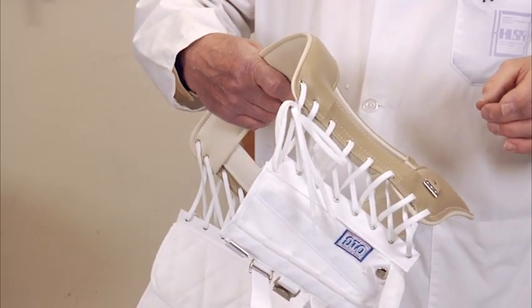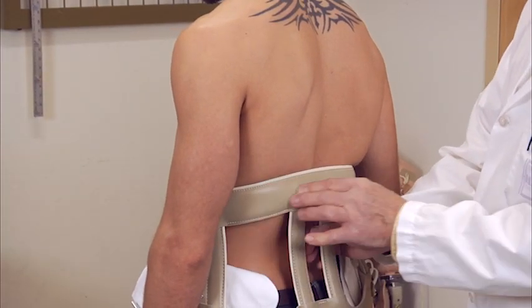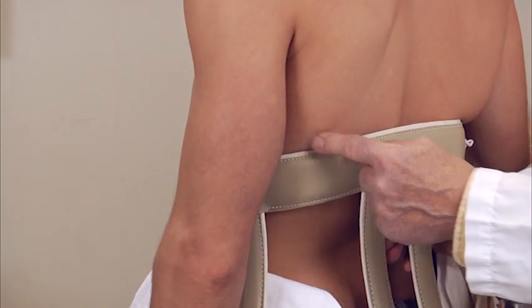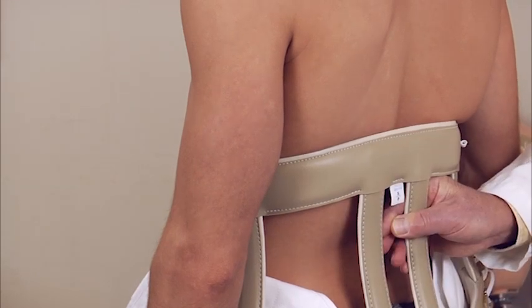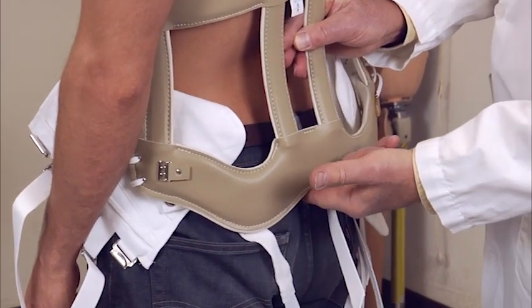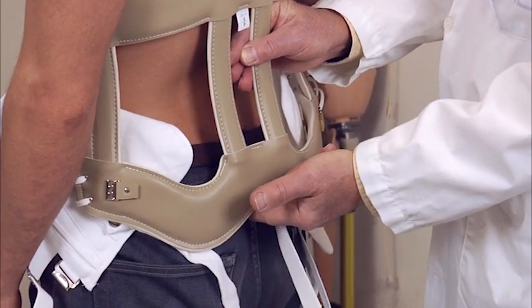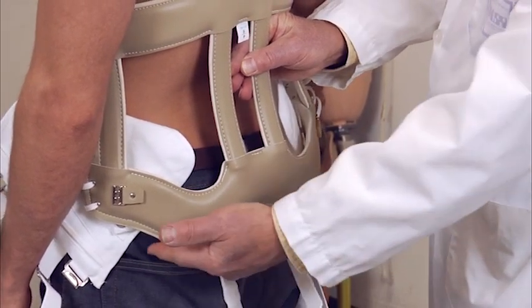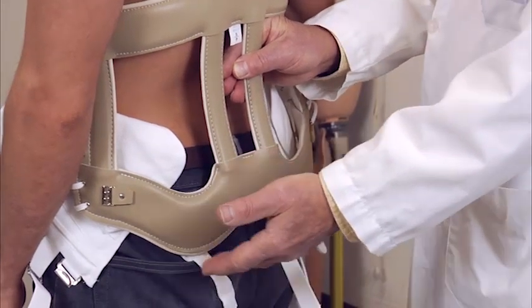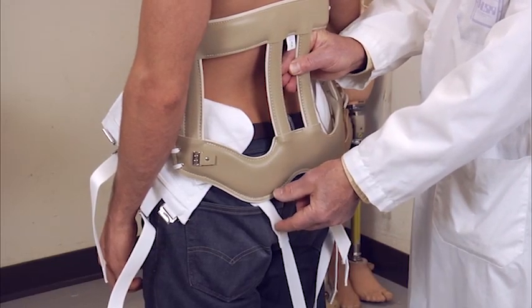Normally, this is a lumbosacral orthosis. We want the superior band to be about an inch to an inch and a half below the inferior angle of the scapula. For the distal band, if you put your finger at the top of the coccyx, this should be at the top of the coccyx. The lower level should be about mid-buttocks. The reason for that is when the patient sits down, this should be approximately one inch off the chair.